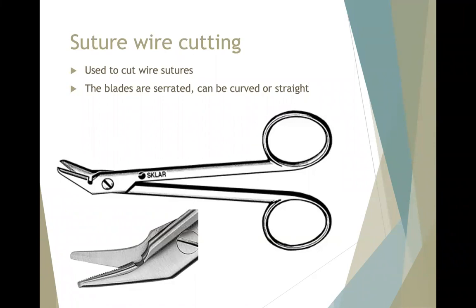The patients can actually still eat and still chew their food just fine. And we'll see a little bit of the wire exposed on the caudal aspect of the lower mandible behind the incisors. We'll need to take the suture wire cutting. We usually leave these wires in for up to 3 months. It really depends on how fast it takes for those bones to heal back into place. And then we can take these wire cutting, cut that wire and slowly remove it out of the jaw.